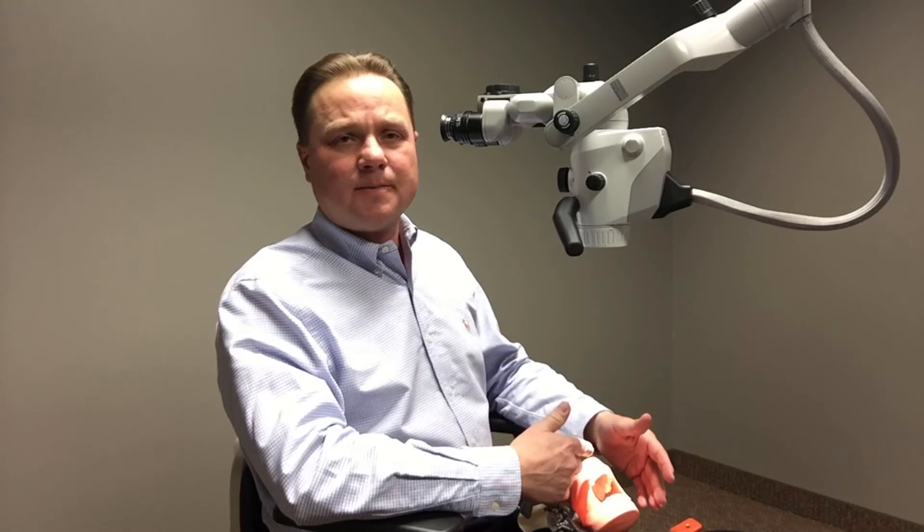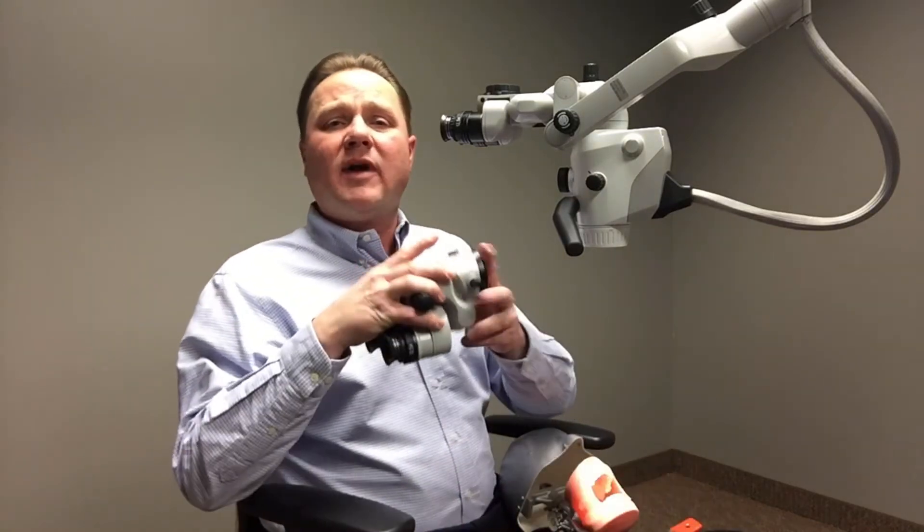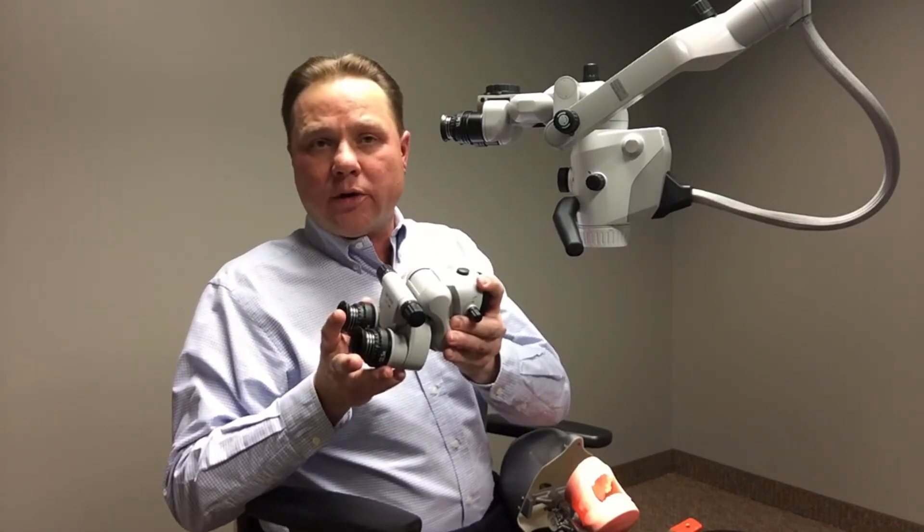The third is very helpful for doctors that like to sit a little further away from the patient. What we have here is our standard zero to 180 inclinable binoculars. But one of the options that we do provide is our foldable tube.